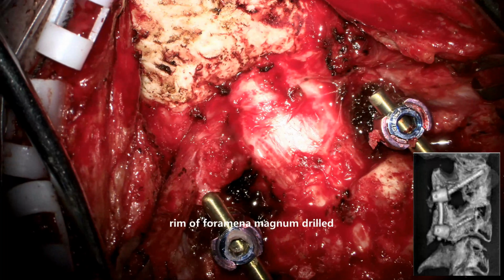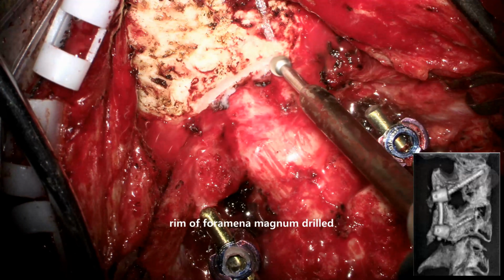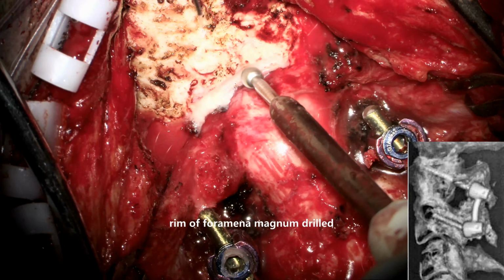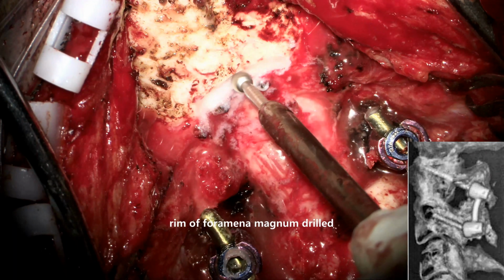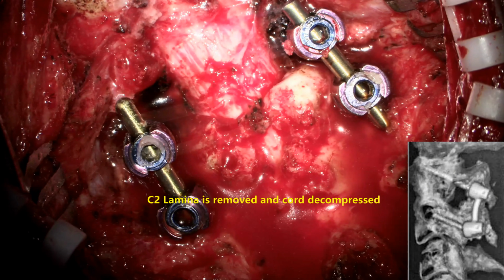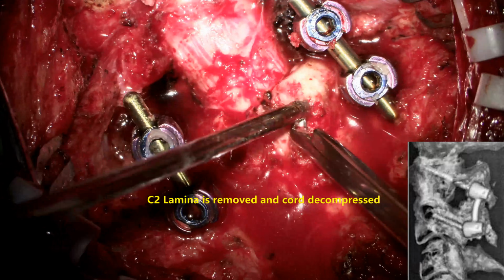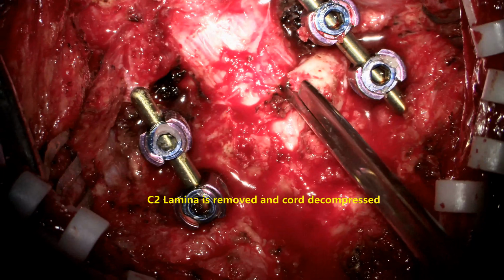Now the duramater is well exposed. We prefer to drill the foramen magnum, the posterior rim of the foramen magnum, and make it raw. The cortical bone is exposed so that we can put a graft between the foramen magnum and C2 laminae to achieve posterior bony fusion in these cases. Now we take off part of the laminae of C2 and we can use it as a graft.